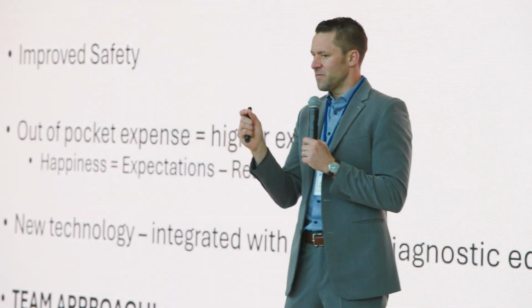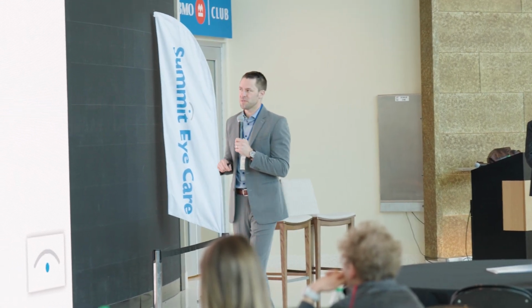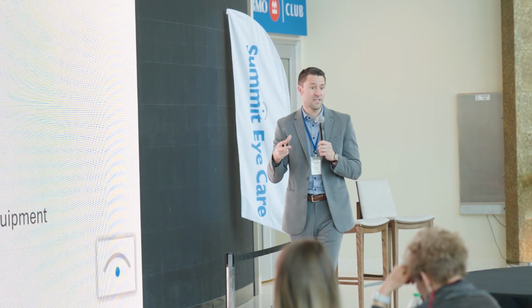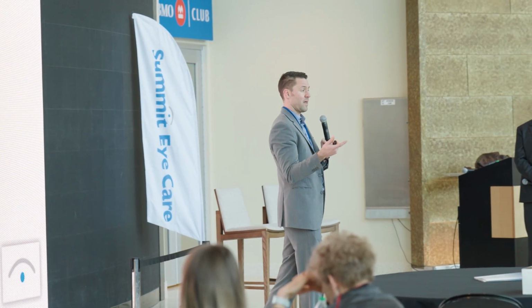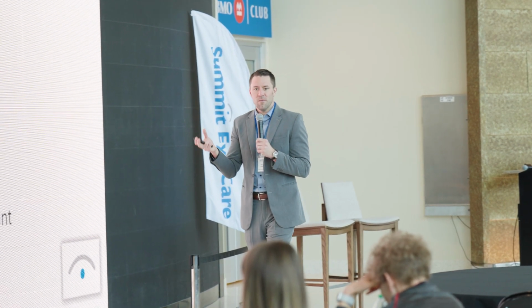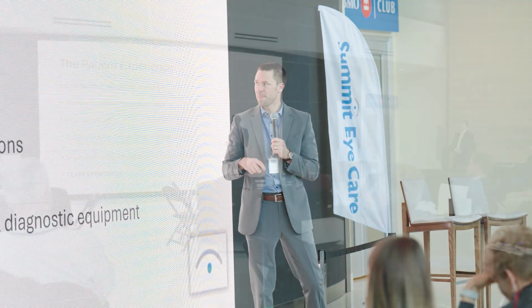But I do ask you as optometrists, if I said that you had 0.75 diopters of astigmatism, would you correct for it in a pair of glasses or a pair of contact lens? Probably, right? Why wouldn't we put 0.75 diopters in a spectacle prescription? Well, before FLACS and before the Lensar system, we really weren't able to correct for that low amount. Toric lenses, toric IOLs, come in 1 to 1.5 diopters. So anything less than that was going uncorrected. So you've got patients who didn't think they had any astigmatism now ending up with about a diopter because of surgically induced astigmatism or just uncorrected corneal astigmatism.